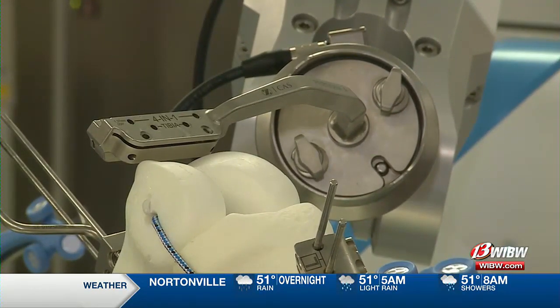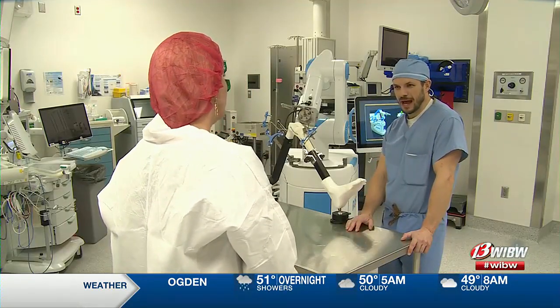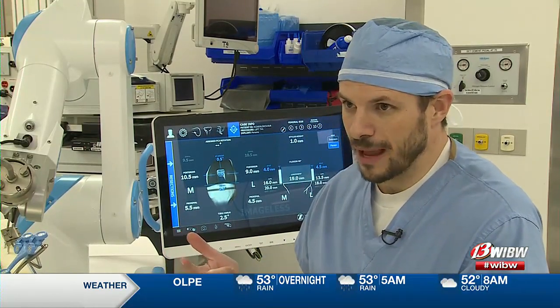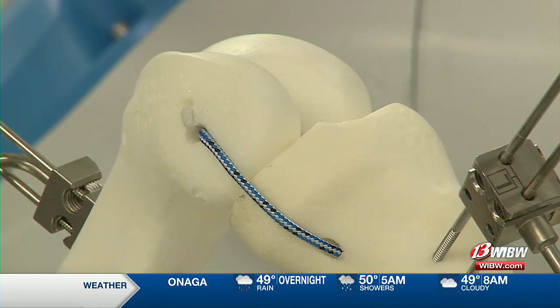It's hoped that maintaining alignment with fewer cuts will increase patient satisfaction. The idea behind it is that by not releasing soft tissue, it would improve recovery, decrease post-operative pain, and improve long-term function — and keep people moving in the right direction.